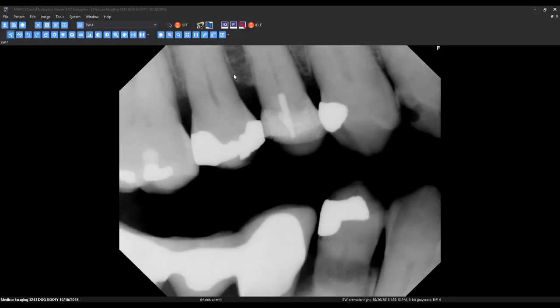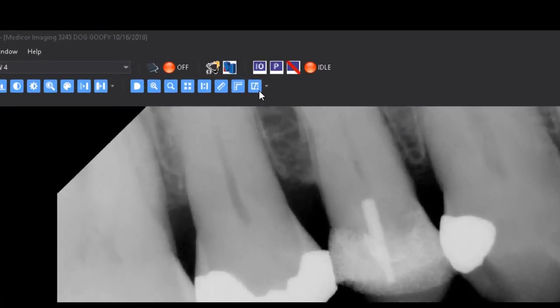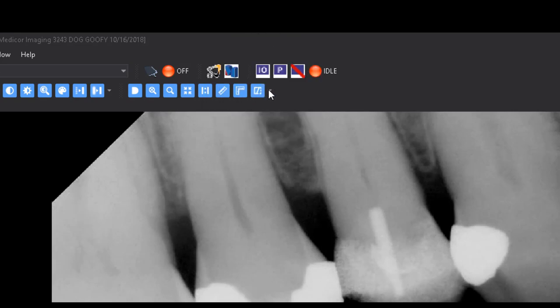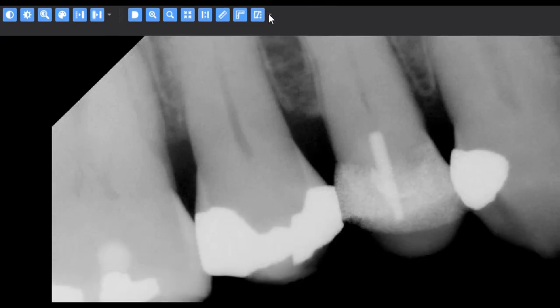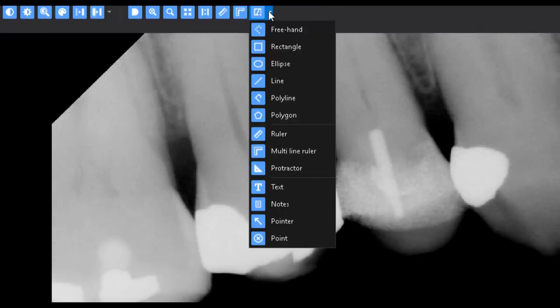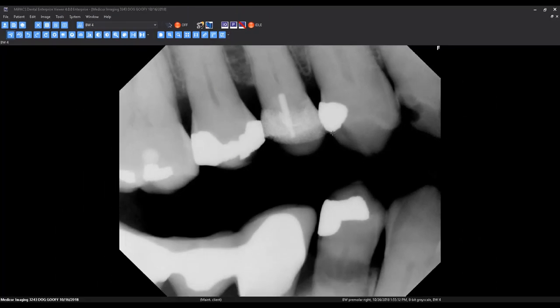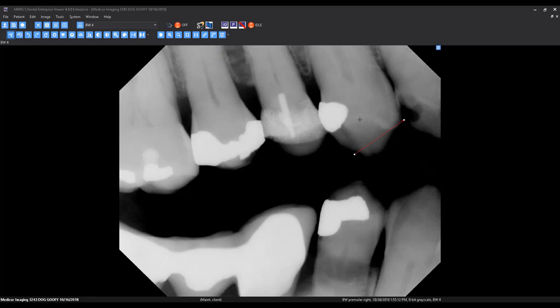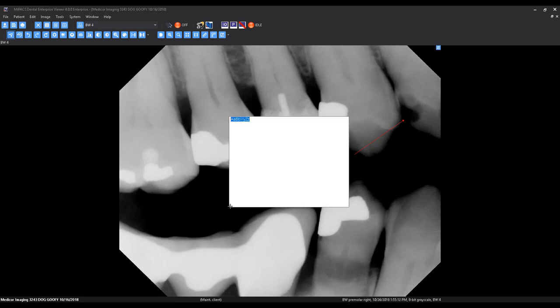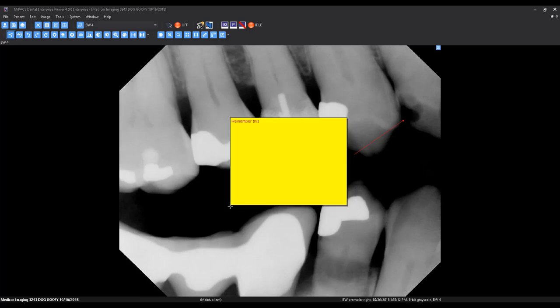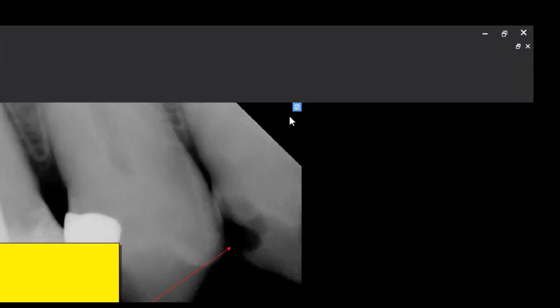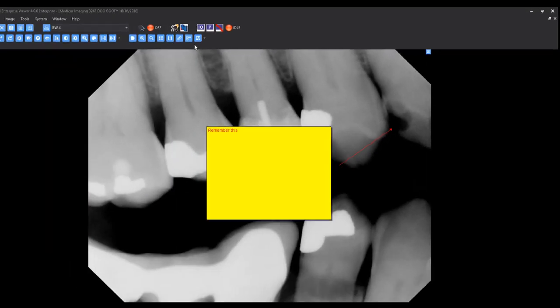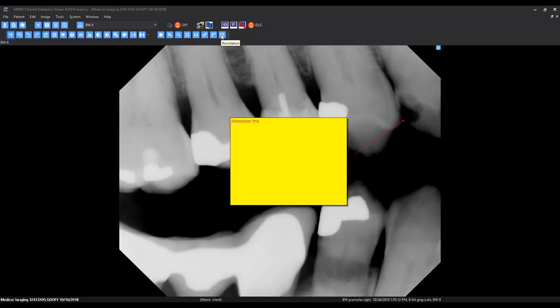Various informational overlays or annotations can be applied to the image. These can be in the form of lines and pointers indicating an area of interest and also text-based descriptions. Annotations are not embedded in the image and can be toggled on and off by selecting the annotation button on the toolbar or selecting the blue icon in the upper right-hand corner of the image.